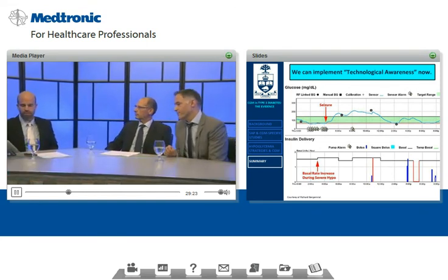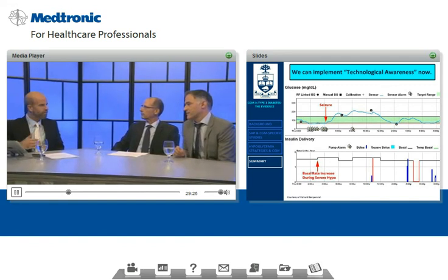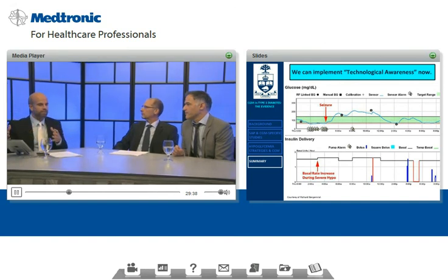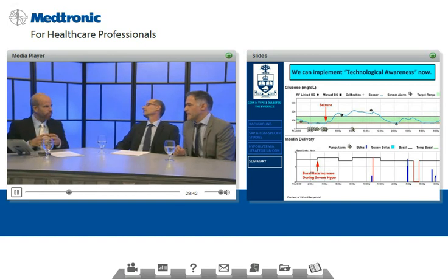Excellent. Well, we'll look forward to those future publications down the road. Just one final question. Being that the evidence is certainly growing and is quite complex, if a patient comes to you and asks for a quick synopsis of how pump and sensing and perhaps LGS can help them, how might you synthesize that in a very short way for a patient to make it easy to understand?